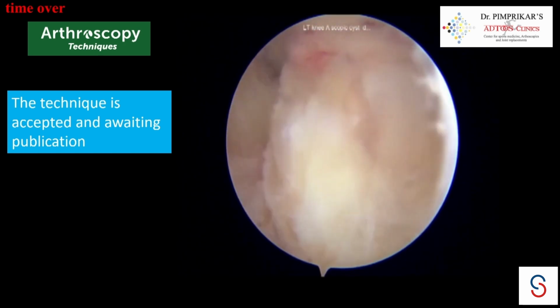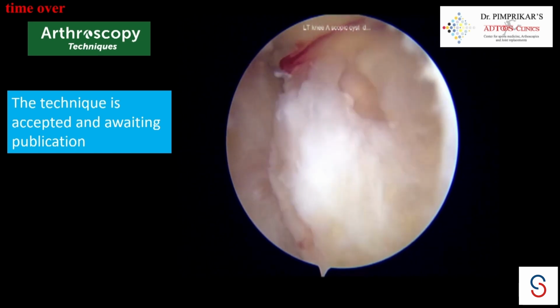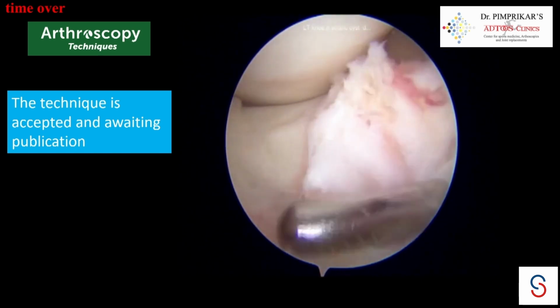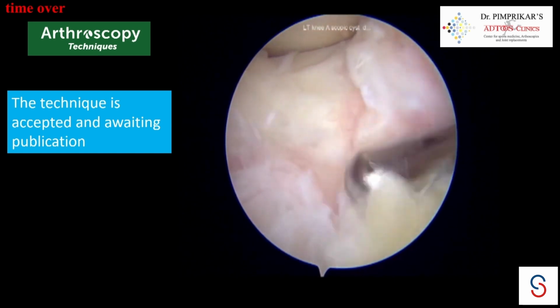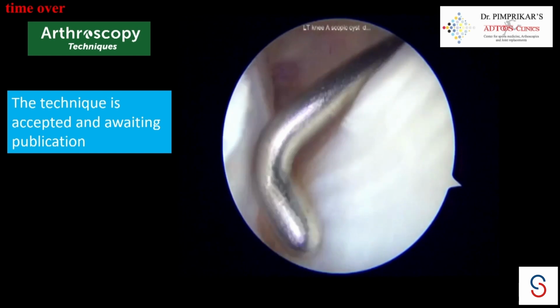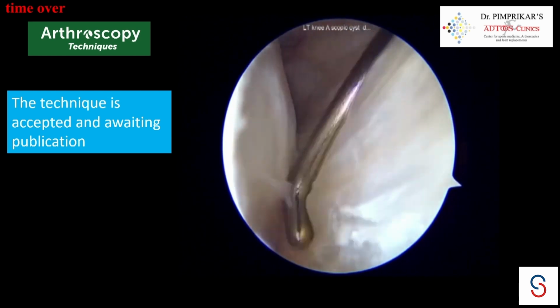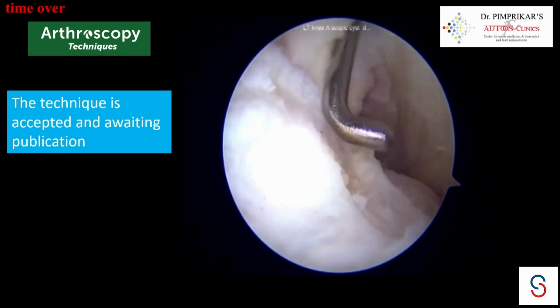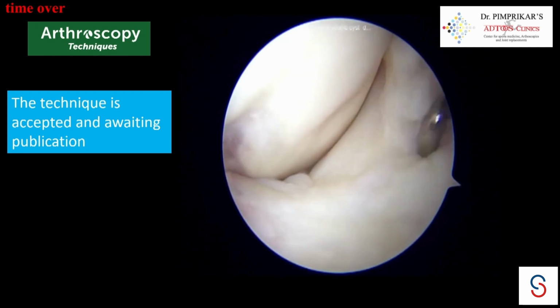Now here what we wanted to prevent was strangulating the anterior horn by the method which we saw previously. So once you shave this off, you are left with the anterior horn of the lateral meniscus and a thin capsule. That's the patellar tendon, retropatellar area, that's the anterolateral aspect of the tibia. So that you find is the meniscocapsular junction.